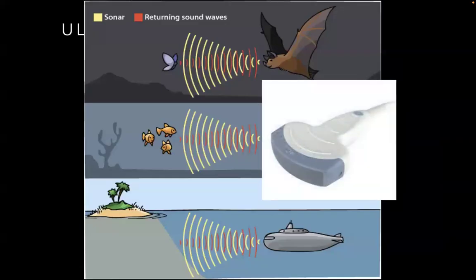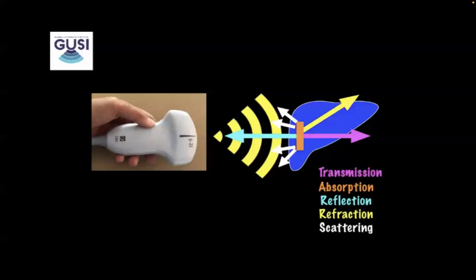The ultrasound probe acts as the sender and the receiver of sound waves. It is with the probe sending these sound waves out into the environment and receiving these sound signals back that the ultrasound machine knows what it encounters in space, depending on these reflecting sound waves returning back.